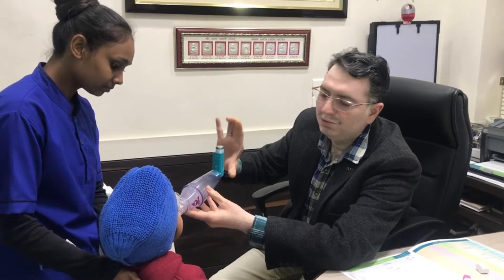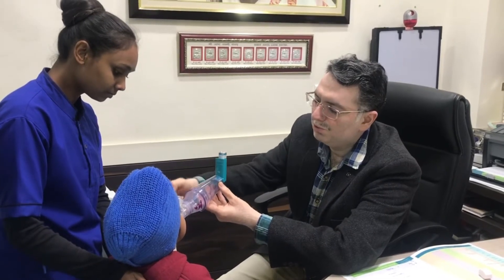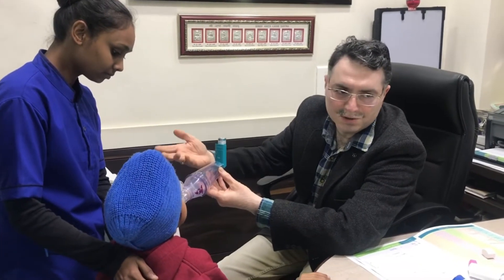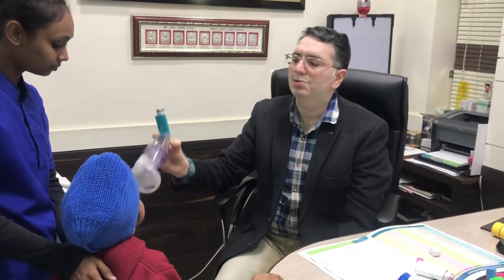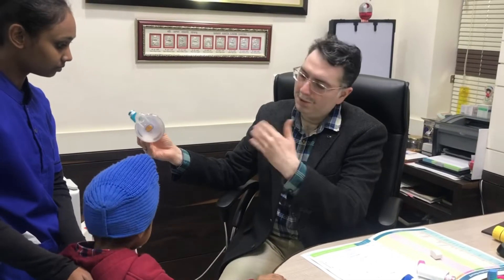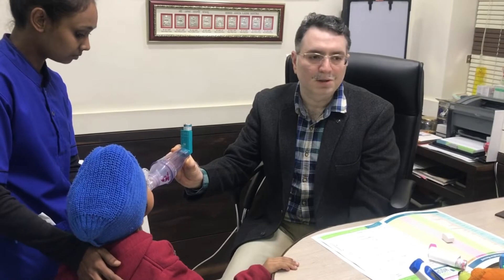After that, we give the puff again. When we give the puff again, the child continues to breathe. We give the puff and wait up to 30 seconds. Some children don't require the puff again until 30 seconds. Then the amount of puff is complete — give the puff and wait 30 seconds.